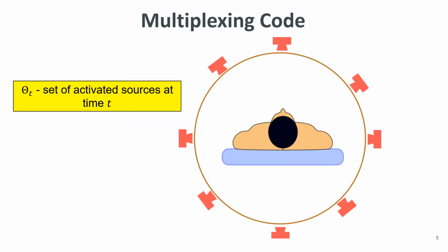The motionless CT doesn't use an anti-scatter grid. This opens us to a new opportunity: multiplexing sources. Multiplexing sources means we irradiate from multiple angles simultaneously, and by that reduce the total number of acquisitions required.